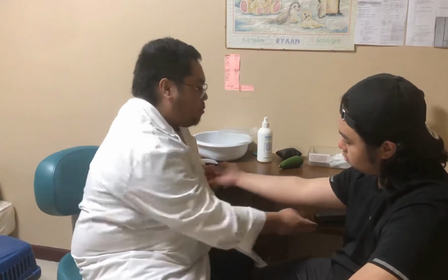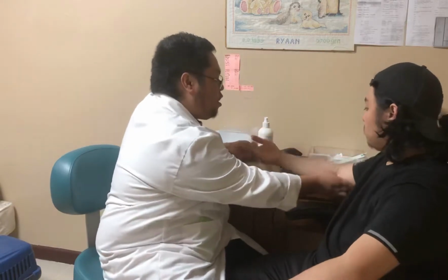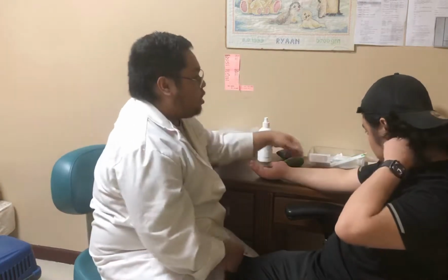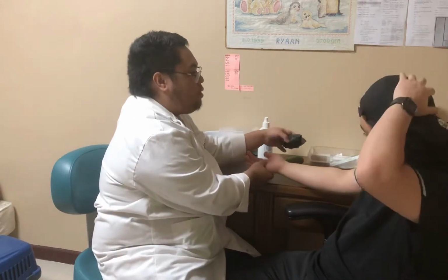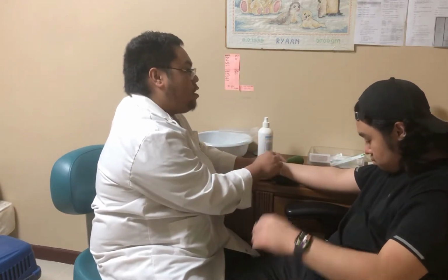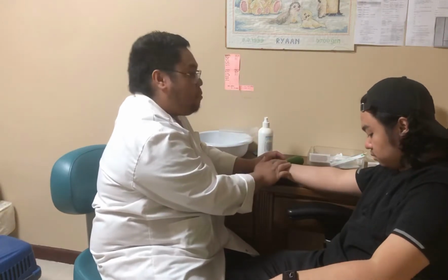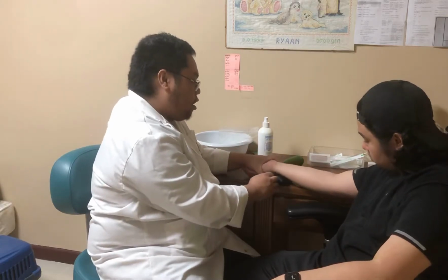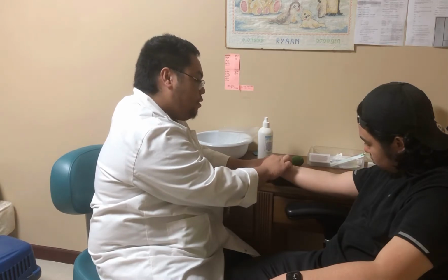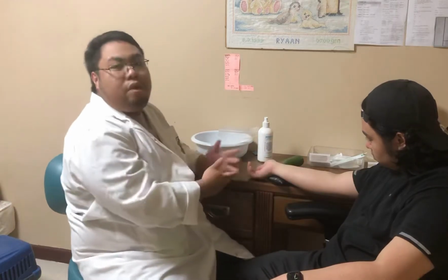puncturing. So now we're going to position our patient in a semi-recumbent position. We're going to put his arm on the side, and we're going to slowly elevate it and dorsiflex it using a small pillow. Basically, dorsiflexion of the wrist moves the artery closer to the skin surface, which makes the artery easier to palpate. After this, we rotate the patient's hand until the artery is palpable. So it is palpable, and the patient is ready for puncture.